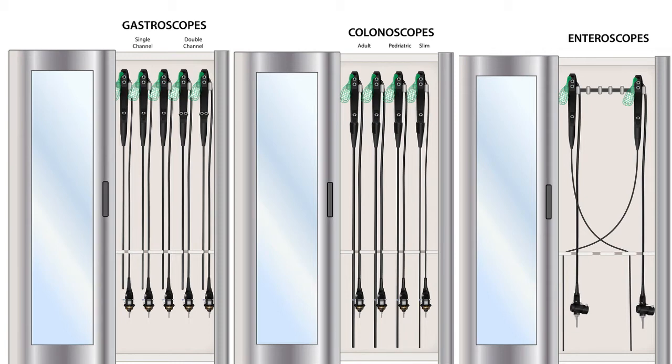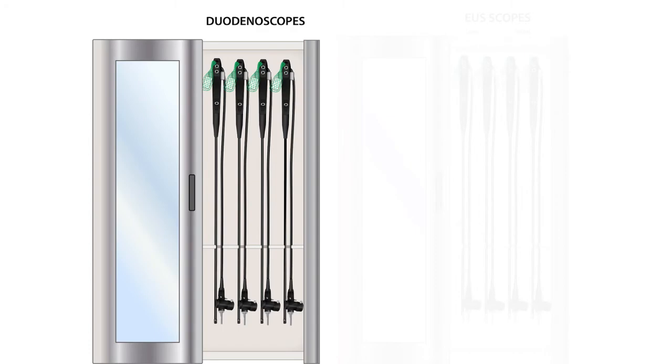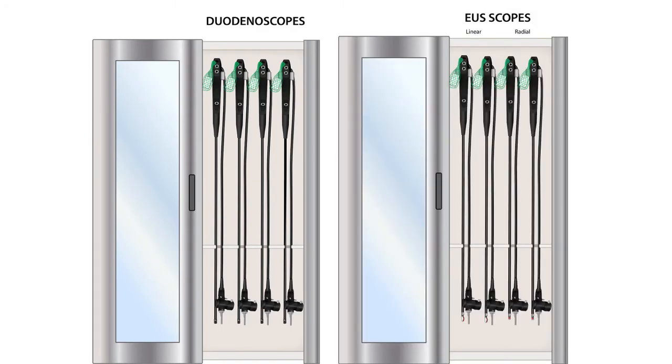So, let us move to the specialty scopes, duodenoscopes and endoscopic ultrasound scopes. So, let us look at the specific differences.